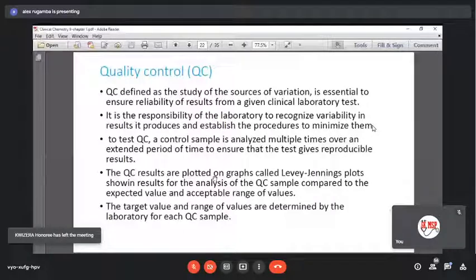And again, tomorrow you also measure before you start the work. And Sunday, every day, and you plot that result somewhere. You write that result somewhere. That is the internal quality control. So it's the quality control that you perform before you start the work. And you control your reagents, you control your equipment, and you control even your attitude. You have to control.